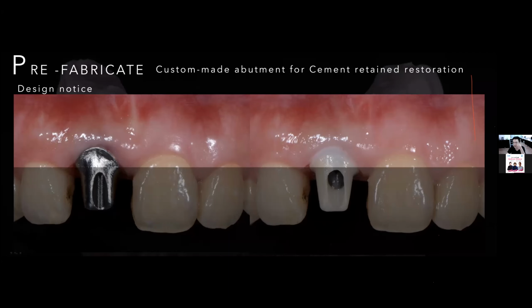And another interesting thing is that we can see the tissue. This is not a very thick type, but you can see the titanium abutment's tissue is exposed to a little dark shadow and it's more black. I think the patient doesn't like this view.